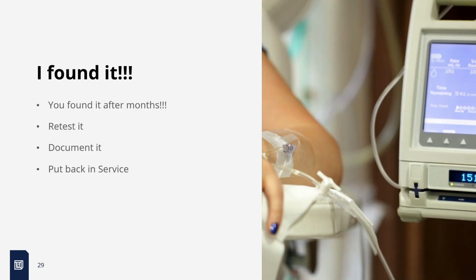One thing again from Kelly Proctor from DNV, probably one of the number one things they ding people on, technical term, dinged. In Joint Commission, I think it's dung. They have to use different languages there. But it fails, you retest it and it passes. Many people don't document the retest, don't have that retest document in there as well. So once you do repair it, document the retest, and then put it back into service.